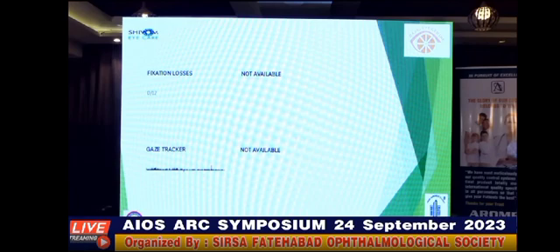So in Octopus, you have many fixation controls like a blink control, contact control when the patient's chin or the forehead is off or away from the machine. Similarly, the pupil position control and dart control. Octopus also has the automated eye tracking, which will prevent the low reliability of the test.